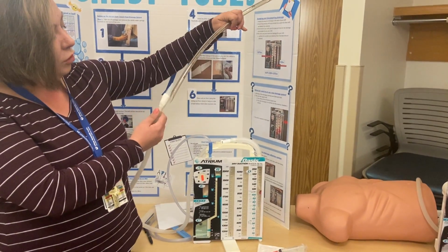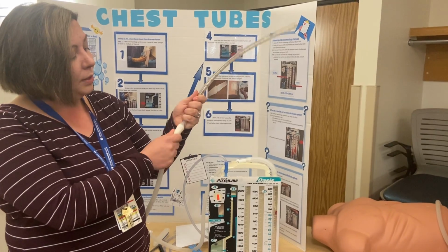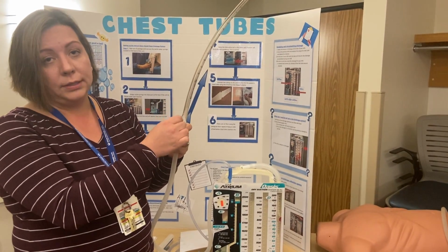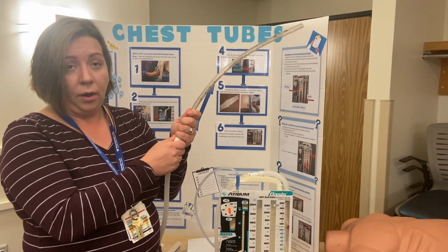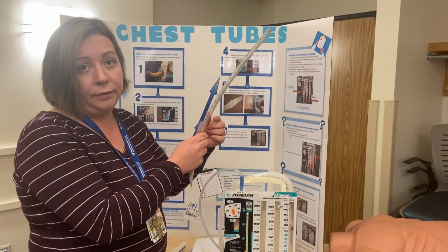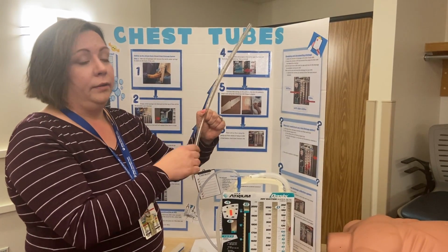This is the part of the chest tube that goes into the canister that goes into the chest tube. It's a little Christmas tree, and a lot of times there's tape that reinforces it. Sometimes maybe the patient starts coughing and turning, and hopefully this doesn't pop off. If this did pop off, you would have your clamps at the bedside so you can pinch it off until you reattach.